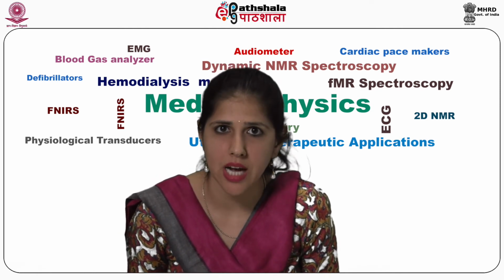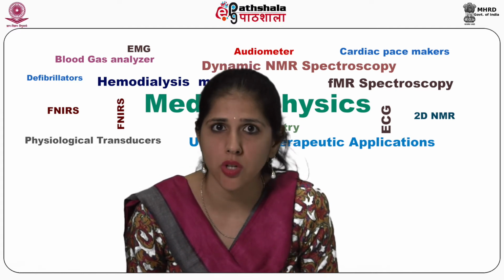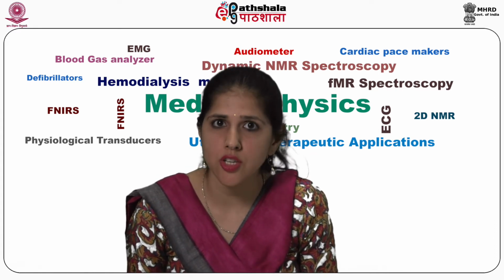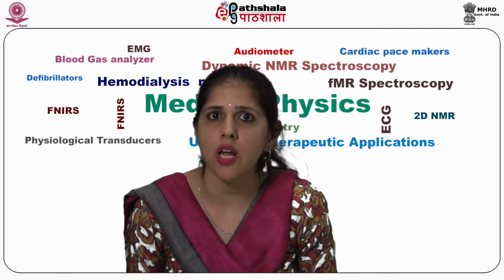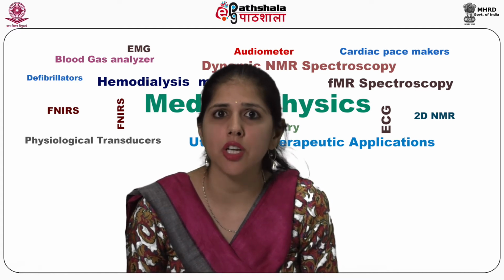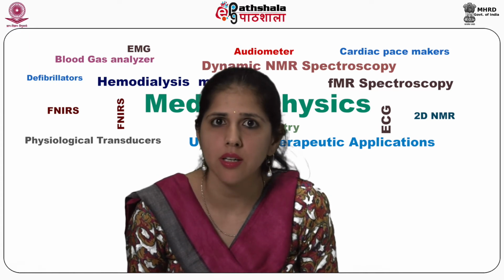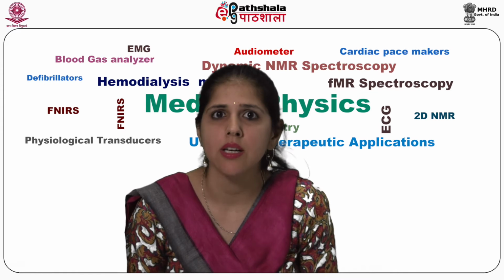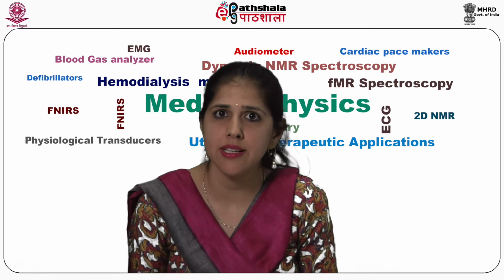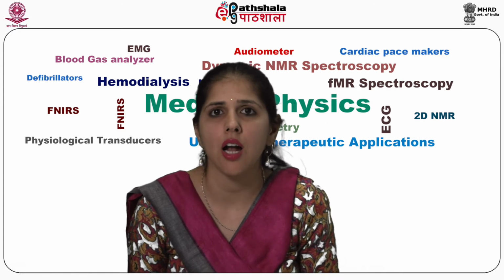Now it's important to understand that, number one, these processes preferably occur for different sizes of molecules. That means for a small molecule, diffusion predominates. For a large molecule or a middle-sized molecule, ultrafiltration predominates. Another difference is ultrafiltration also helps us in maintaining volume homeostasis across the patient's blood sample. That means excess fluid would also be drained out by the process of ultrafiltration. Hence, the dialyzer uses both these physical processes of diffusion as well as ultrafiltration.